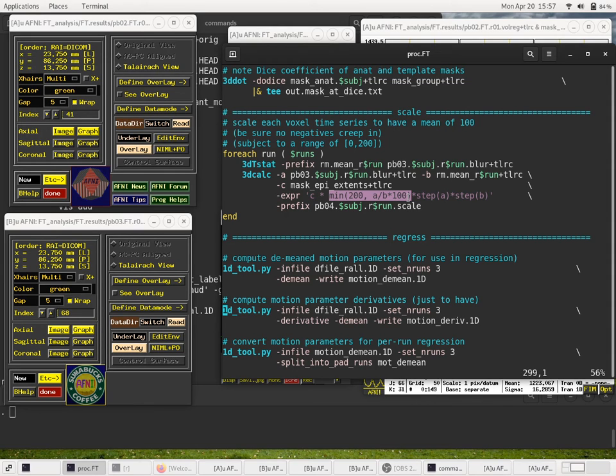And that's just if we're still dealing with signed short dataset values, 16-bit integers. With signed 16-bit, you only have 15 bits of accuracy. You can only have 32,767 numbers in that, because we're not dealing with negatives at this point.